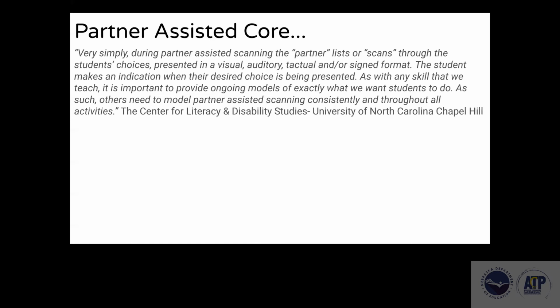But while we're working on that access piece, we don't want to not work on the communication. So in order to have a systematic way for us to help support their communication and have all this robust vocabulary together, we use Partner-Assisted Core.